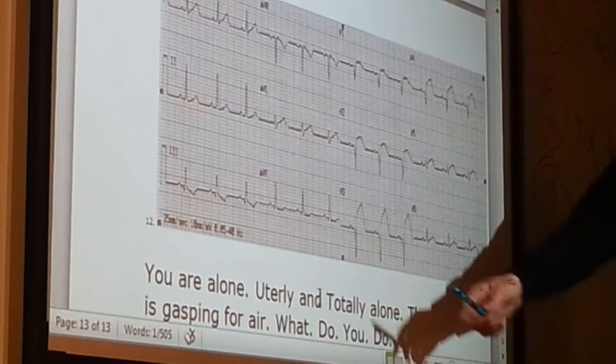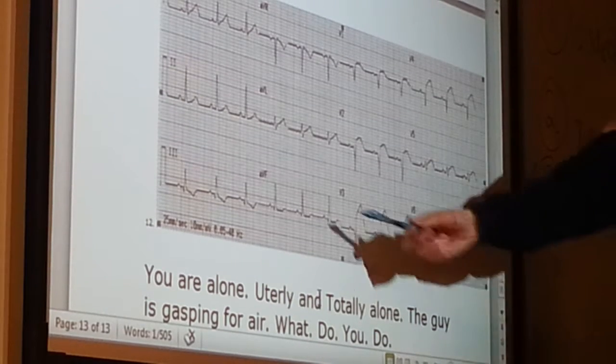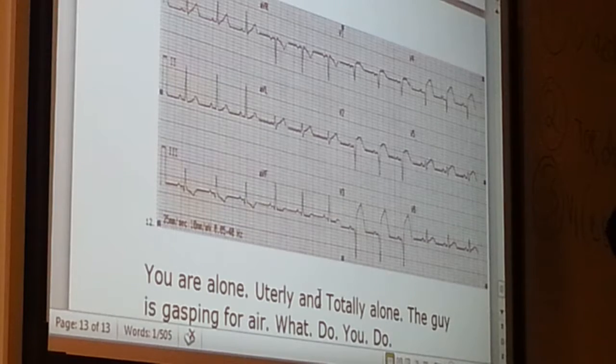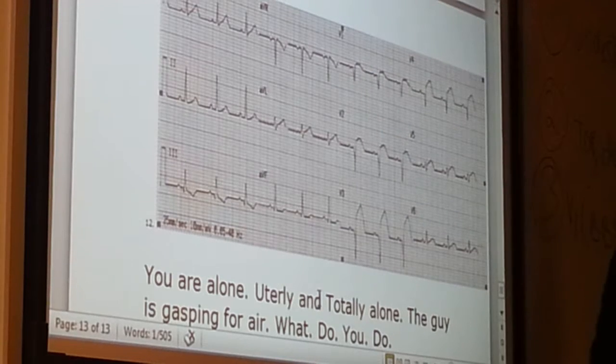All right, so for AVF, it looks like it's normal again, but the ST is again depressed below the isoelectric line, just slightly, but it still is below. So then for V1, same thing, but it's flipped. You can see here, the ST segment is again being silly. So what's going on with the ST segment, other than it's being silly?